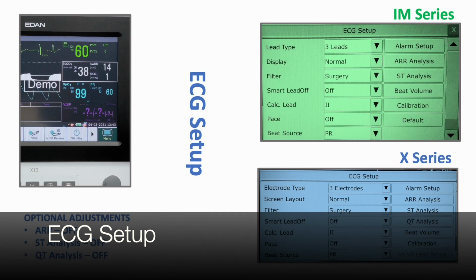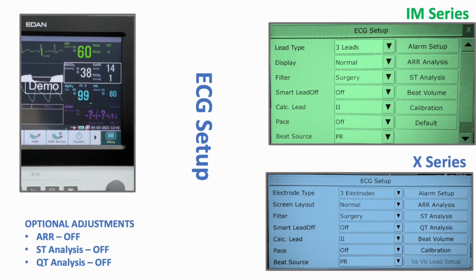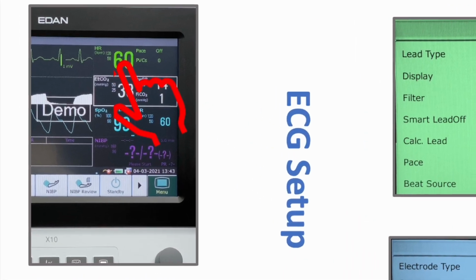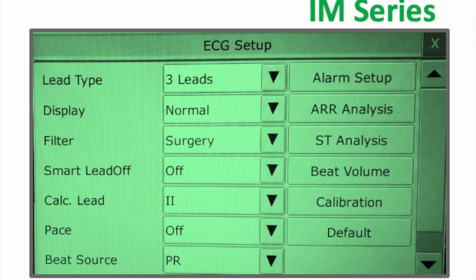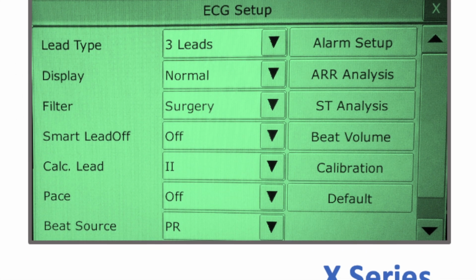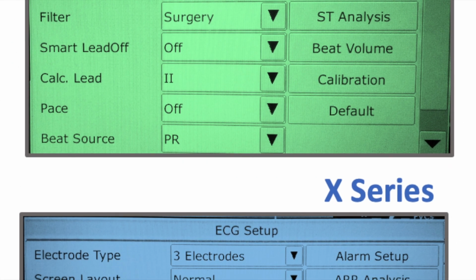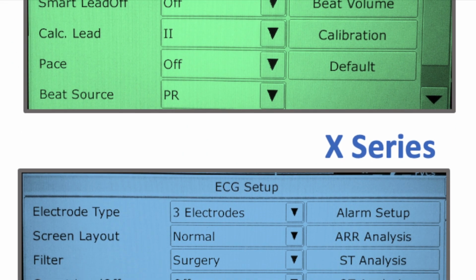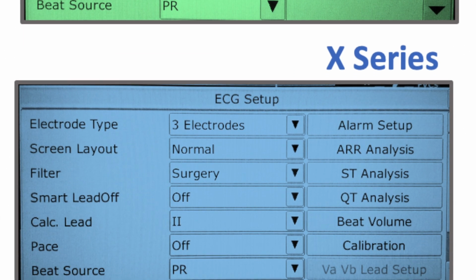ECG Setup. Enter ECG Setup by touching the HR parameter box. This should be to the right of the ECG waveform. The recommended settings are shown for each monitor version. Lead type should be set to 3 leads, display normal, filter surgery, smart lead off, calc lead 2, pace off.